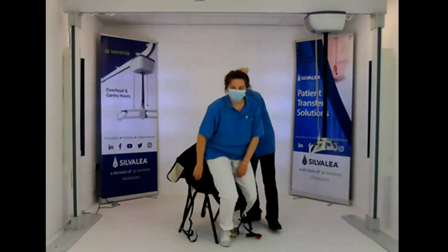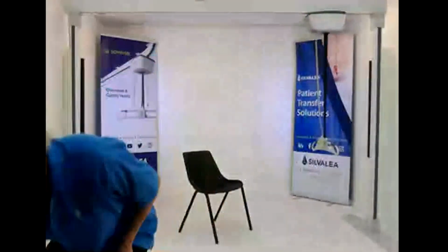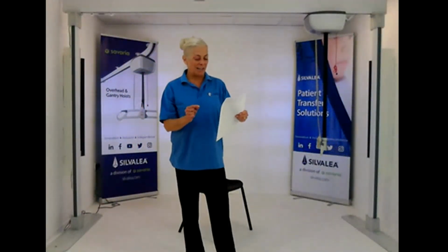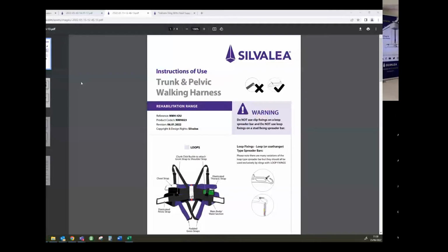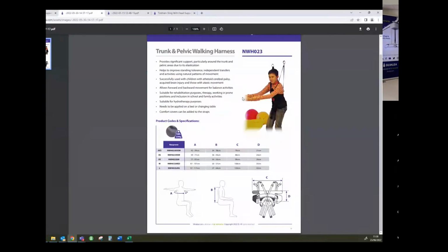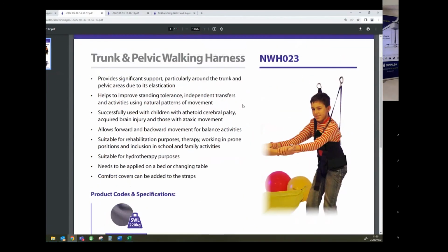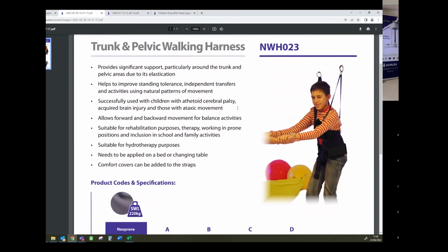So the last style, thanks Laura, is a harness which is a particular beast and difficult to explain. So I'm hoping Alice will bring up the data sheet on the website so I can just talk you through this harness. It's very complicated, and it needs to be applied on the bed, and it probably will be one of the videos we do to start with, because when we've got an angled camera we can film it better. It's going to be hard to show you on a standing, but we will do our best. But it's a really good harness.